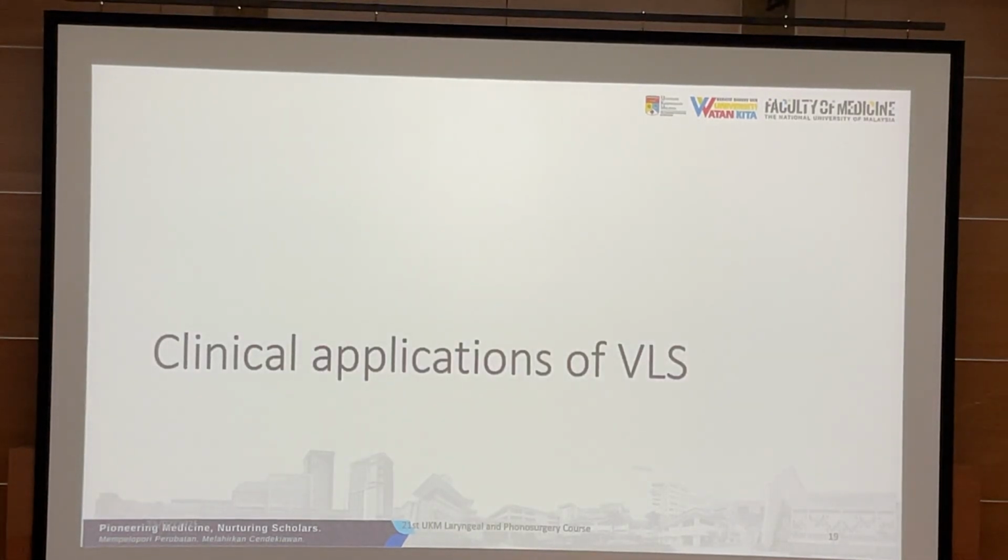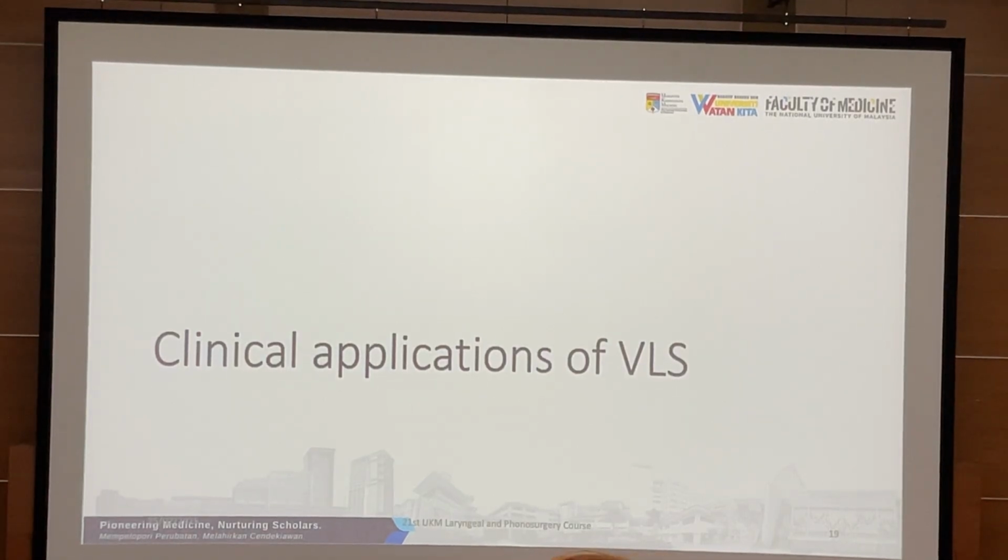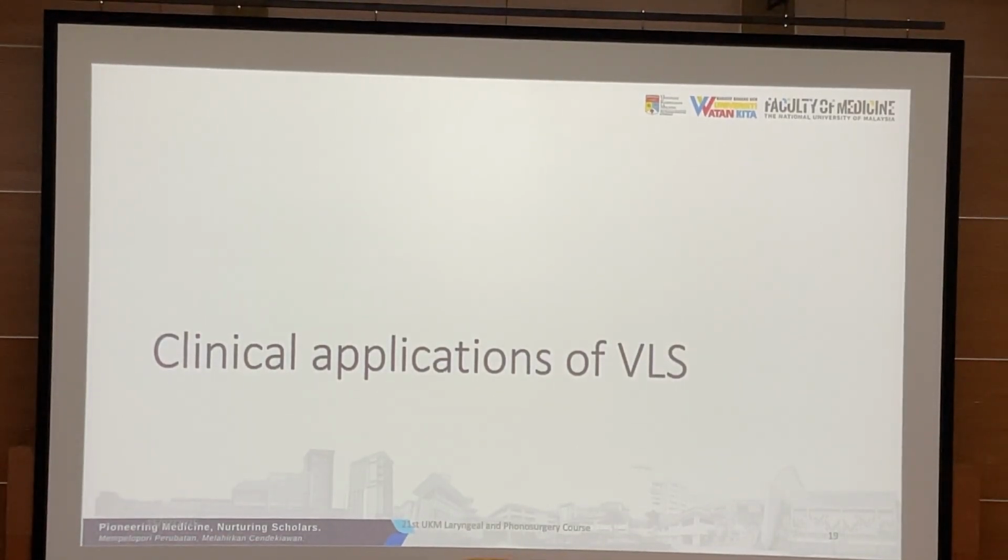Right, now we talk about the clinical applications. Why are you so bothered about having video laryngostroboscopy? Dr. Yakubu, in the UK, for you to run a voice clinic, it is a must to have video stroboscopy. Am I right? So it is like that around the world. It is a must because there are patients who come to you with hoarseness when you scope and find nothing. You can't see anything, especially in those cases, you need stroboscopy to come up with a diagnosis and to see all the little things that can't be seen with the naked eye.